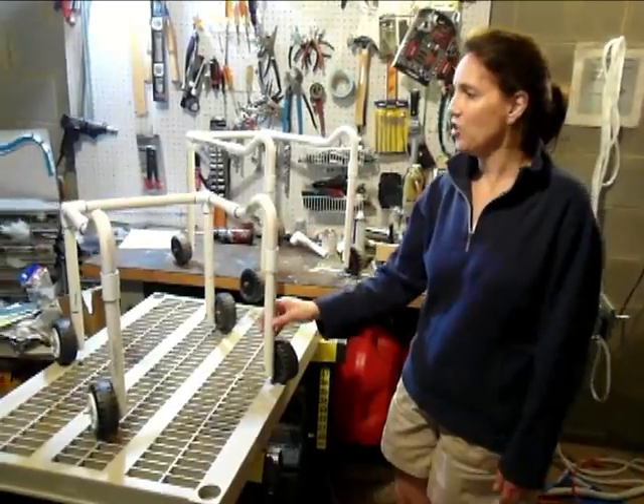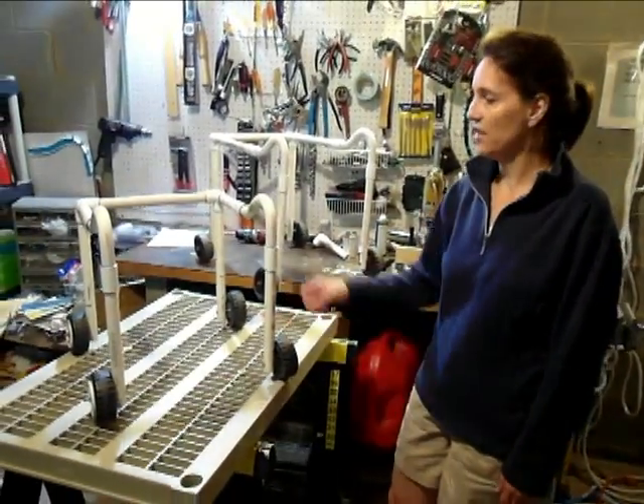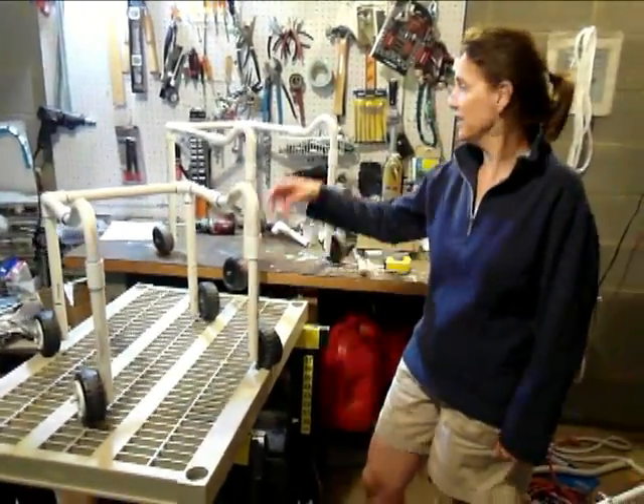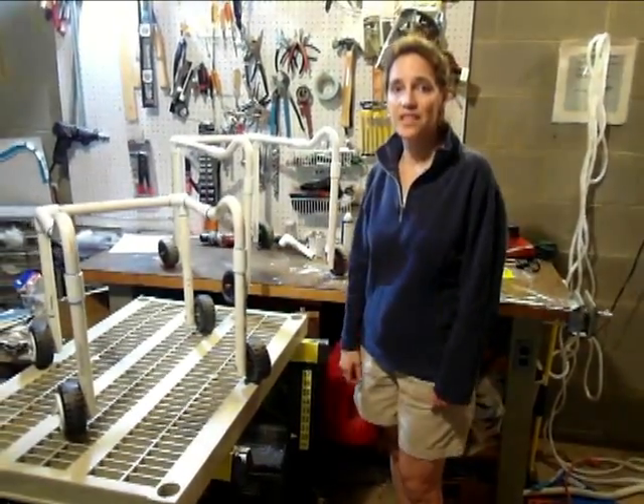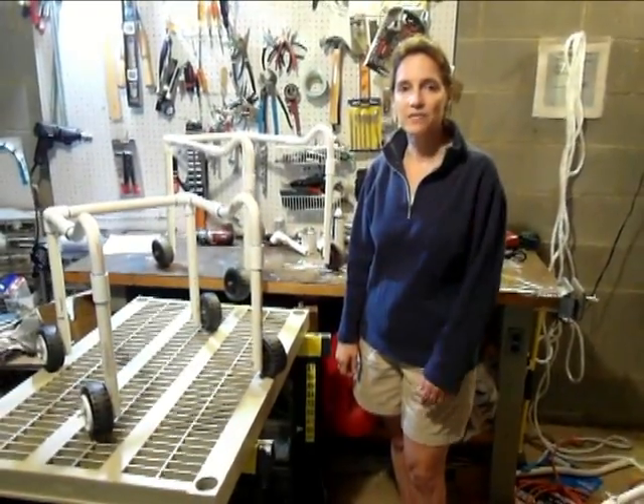You can build them to grow with your child. This is one of the first ones I built. As John got bigger, I built a bigger-sized one. But now let me show you the steps so you can build one too.